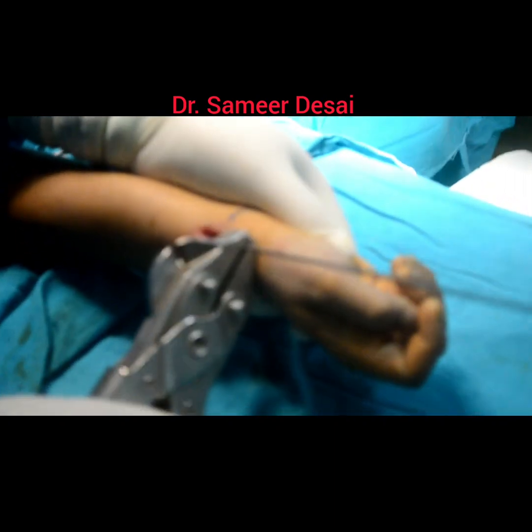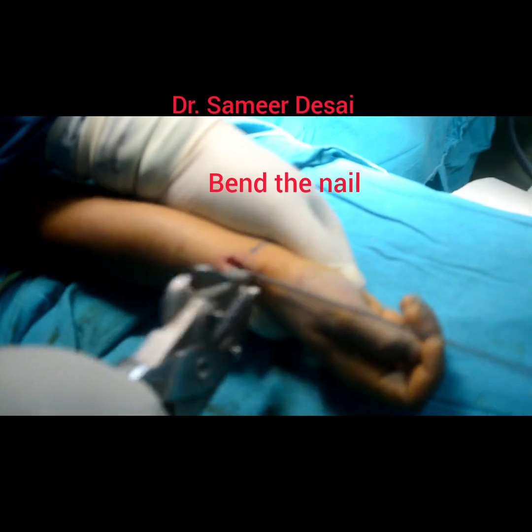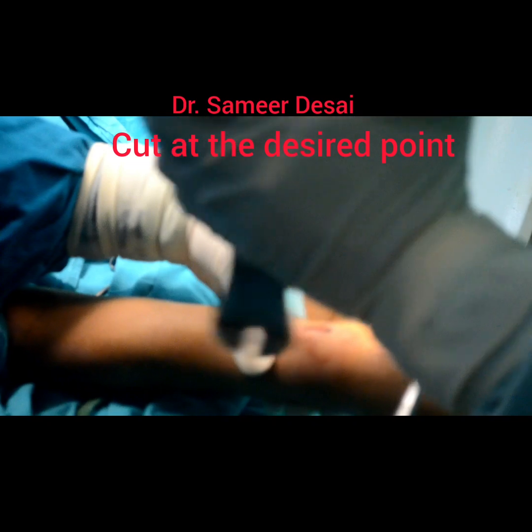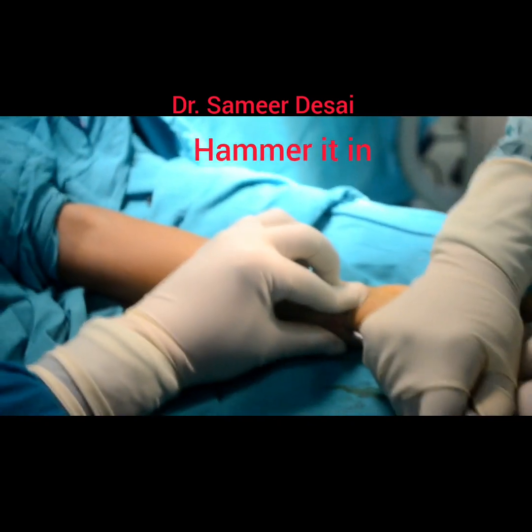Then bend and cut the nail in this fashion. Hammer the tip inside so that the child will not feel it.